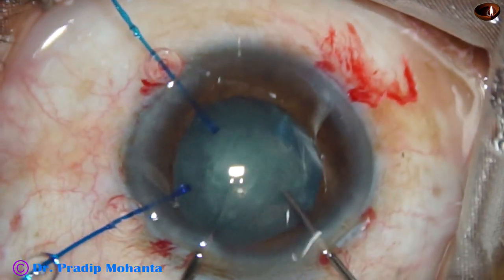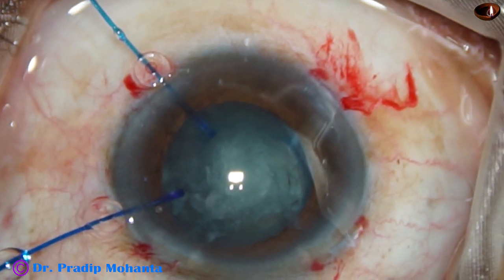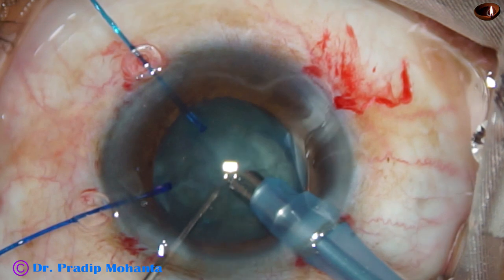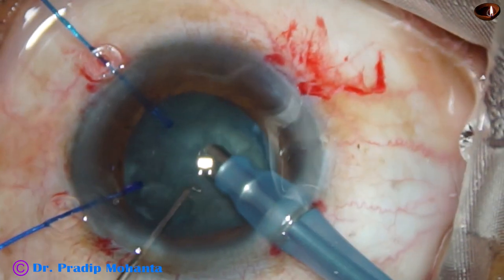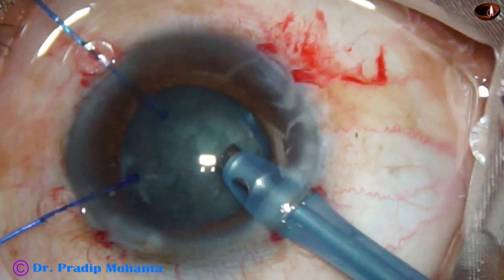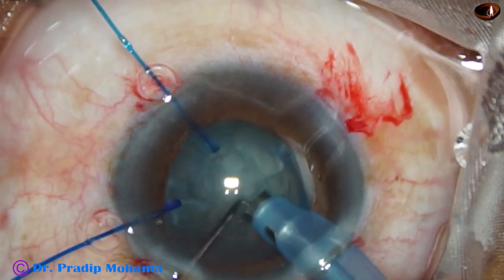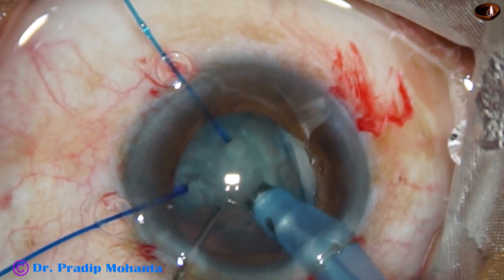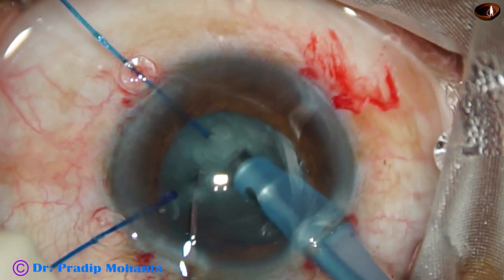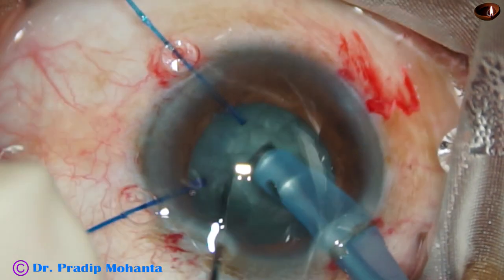Now I try to chop the nucleus by two hooks, but I could not do that. Then I go with the phaco handpiece. Vacuum is very low in subluxated cataract — with this machine I don't use more than 200 vacuum. I am trying to hold the nucleus. I found that it is very soft, so I just mechanically supported the nucleus and chopped it. It was a very good crack.